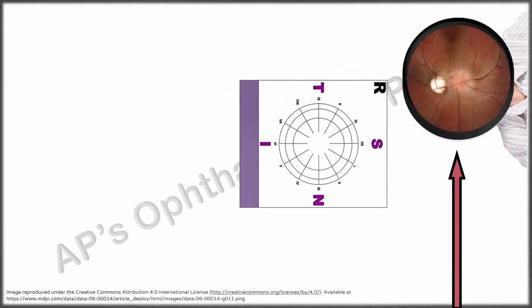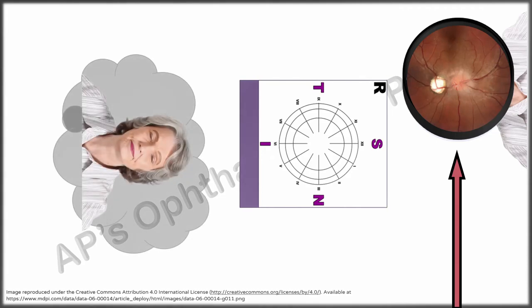This is the patient's fundus. Look at the chart. Now what we are seeing is the fundus of the patient's right eye as if the patient is oriented towards the chart. So this is the optic disc, this is the macula temporally and this is a coloboma inferior to the disc.